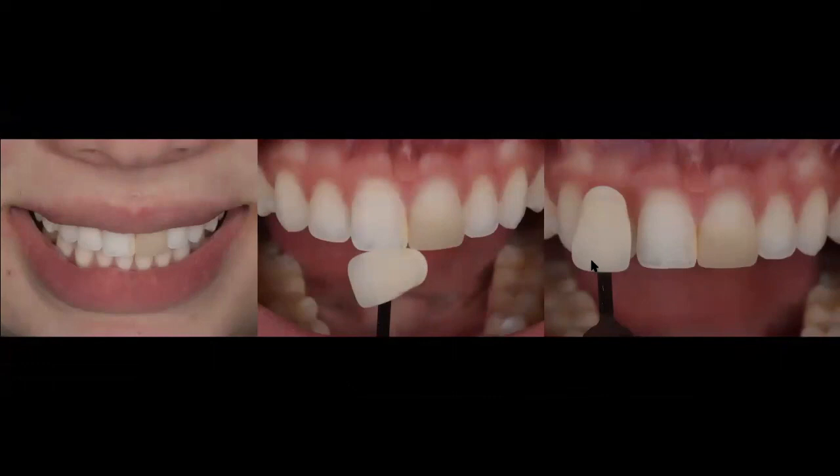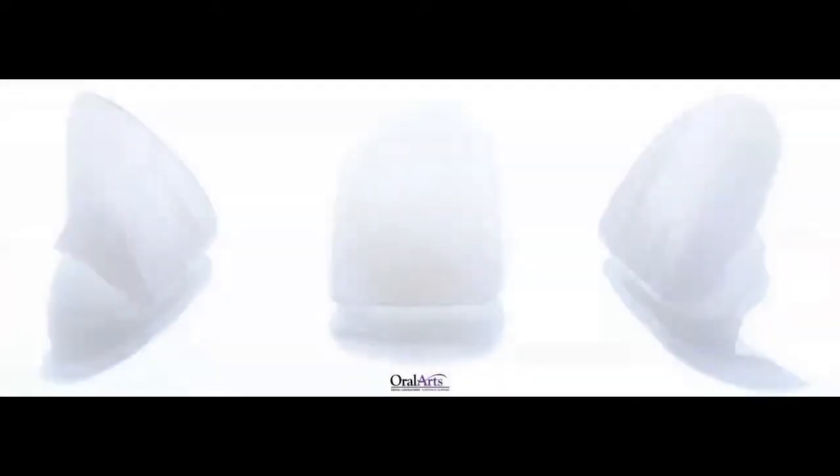I'm not going to go into that detail, but I do use this because, as you can see, it takes away all the glare, and it tells my lab this is the intrinsic anatomy in that incisal third, and the way that the dentin, gray, and white combine to create that halo effect on the incisal third of that tooth. Why do I give them that? Because I want them to reproduce that.